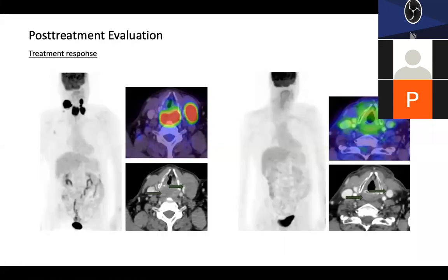So now we'll just go through a few scans of how post-therapy scans look in this area. I'll not go through the post-therapy criteria today because we had already discussed those before in the previous lecture. I'll just go through patterns of uptake we see in post-therapy cases, because the role of PET really comes in post-therapy and recurrent setting.